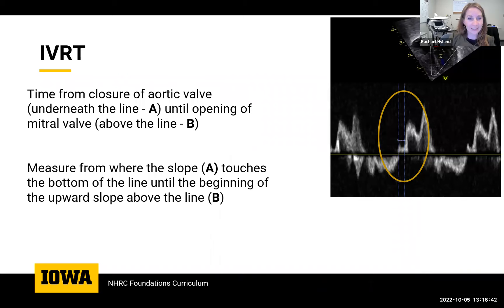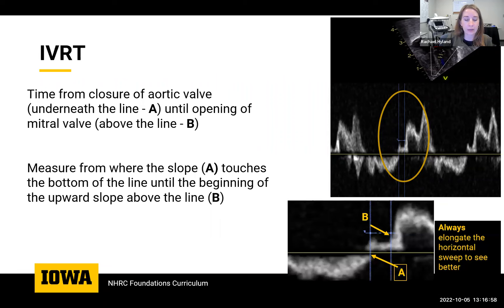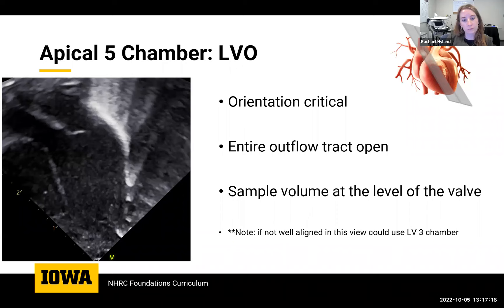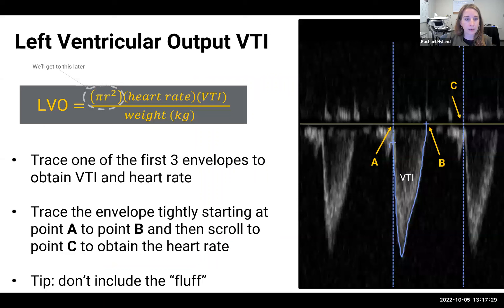For isovolumetric relaxation time, this is obtained from the apical four-chamber into almost apical five-chamber, where you're seeing ejection below the line and filling above. This time measurement can be tricky if there's extra noise in the picture. Elongating the baseline is very helpful to accurately measure, because a really common mistake is ending the IVRT too late. You need to end it as soon as the mitral valve opens — as soon as that slope starts to increase. When moving into the apical five-chamber, a narrowed apical five view gives you a well-aligned outflow track for an accurate LVO assessment.